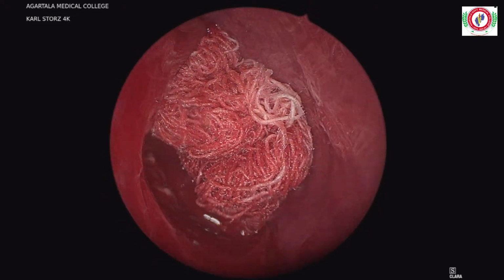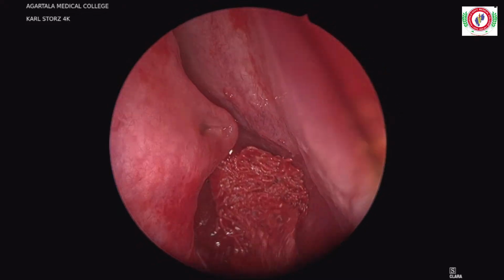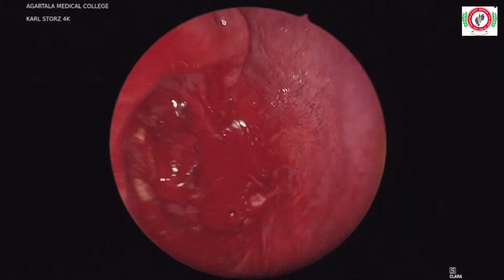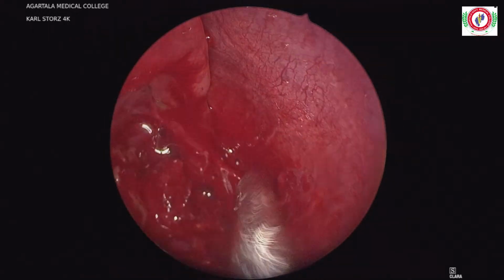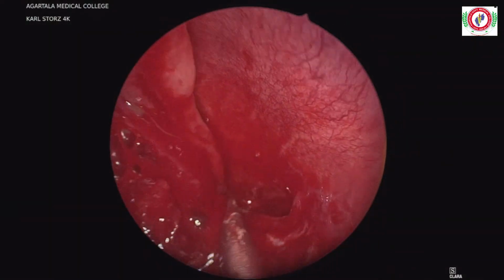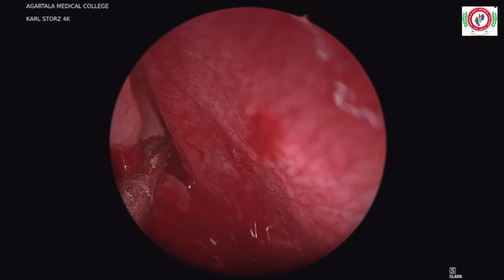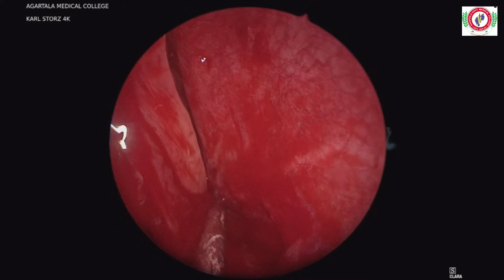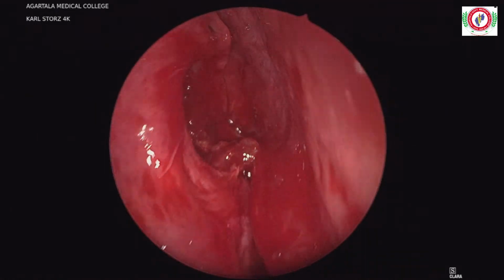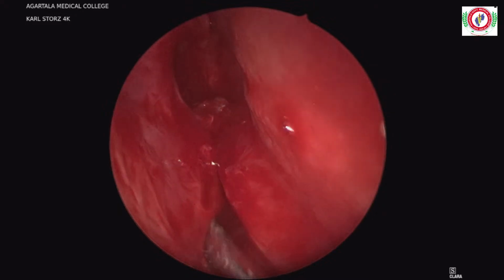So now this is in the maxillary sinus. With this maybe I will leave the tumor in the maxillary and be able to free the nasal part. Let's see. You also have to do suction from the nasal cavity if by chance there is more bleeding. You see superiorly, now can you see? Superiorly there is no disease here. It is all free.